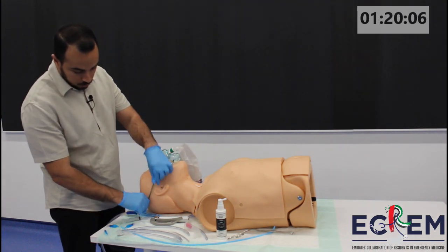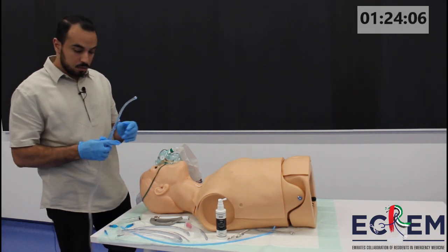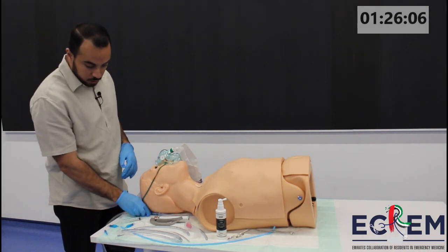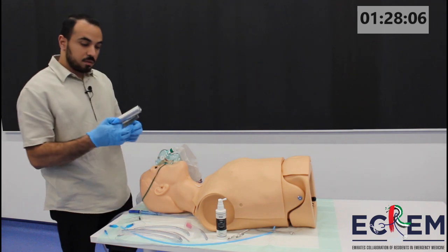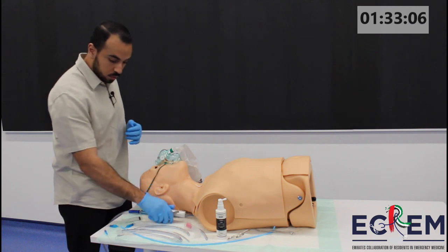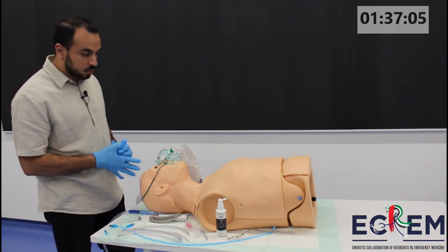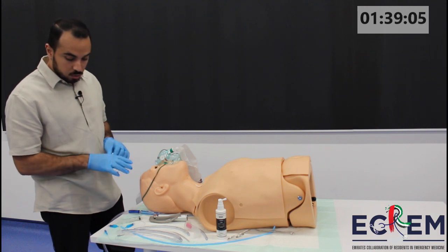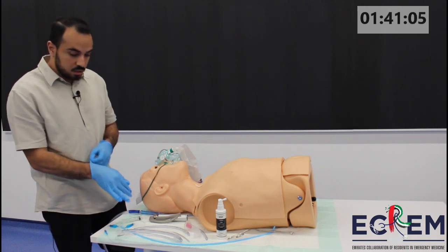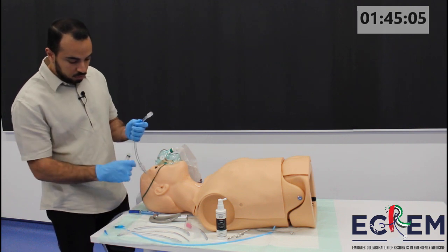Meanwhile, I'll start with my preparation. I have my suction — it's connected and checked. I'll have my direct laryngoscope, and if I have a video laryngoscope I'll make sure it is working. I'll have different sizes of ET tubes. Since this patient is an adult male, I'll start with 7.5, and I'll get 7 and 8 as well. We'll have our 7.5 tube ready.